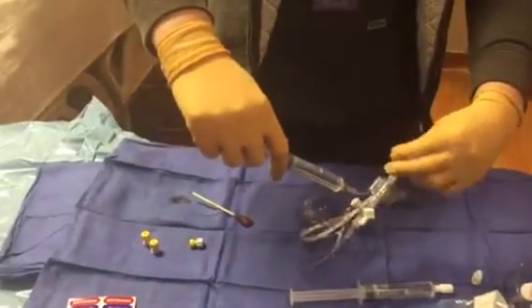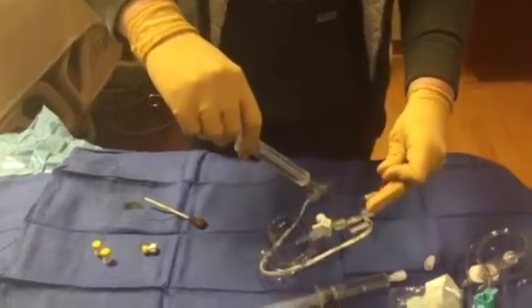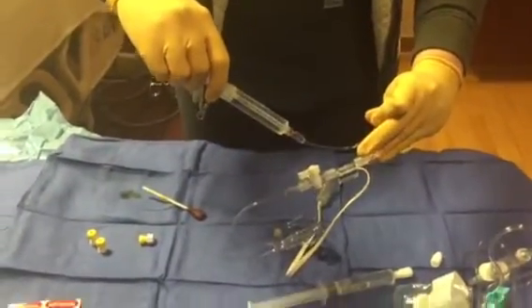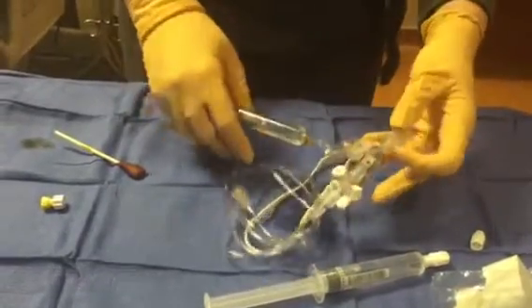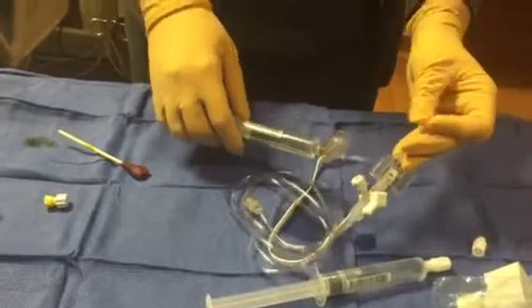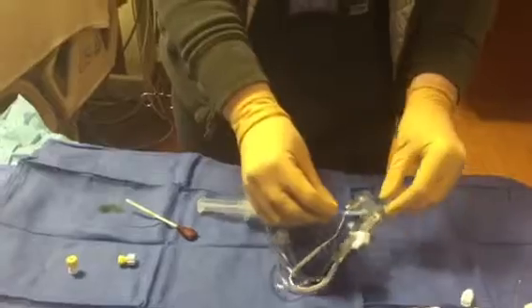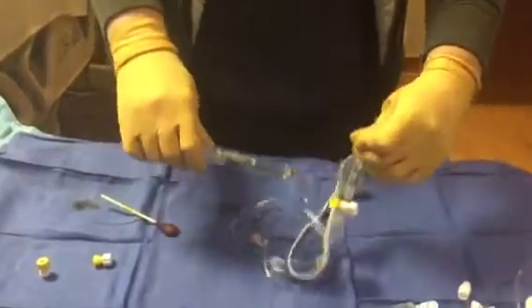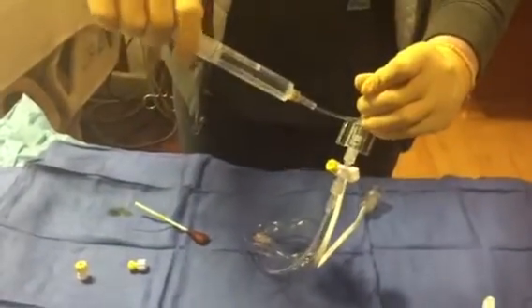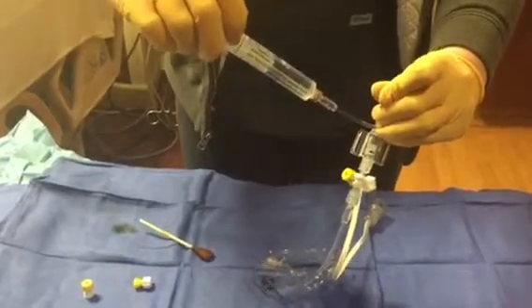She's hooking the sterile saline syringe up to it and pulling the red plunger to flush through. If you look closely, you can see the sterile saline coming through that white port — that's how you know to replace it with a yellow cap, which closes the system. She opens the stopcock to continue flushing through the tubing, and there you see it's completely flushed.